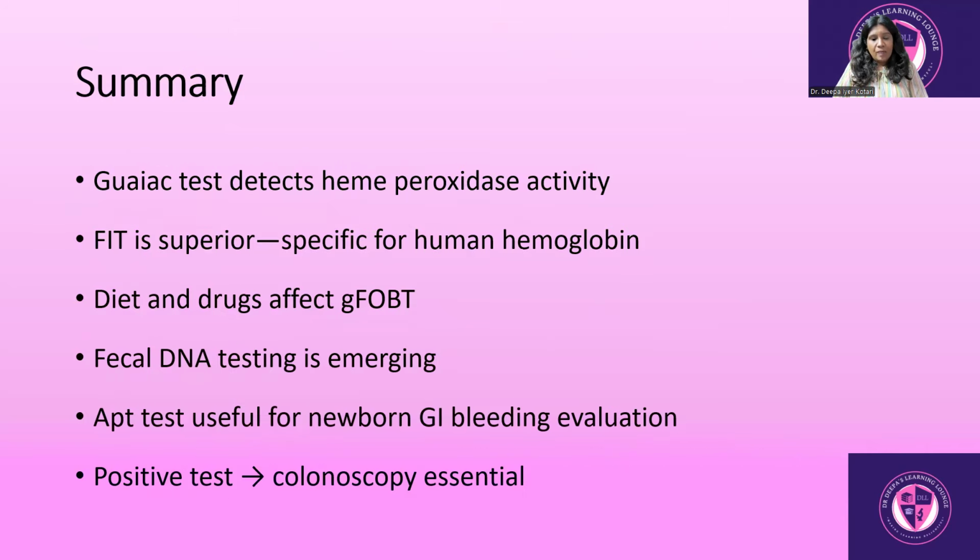So, in summary, what all did we speak about? The fecal occult blood test remains a valuable tool for cancer screening. That is what we spoke about, and it requires understanding of the dietary and technical limitations for the testing. We also need to understand how the patient has to be prepared 72 hours prior to testing, what the false negatives are, and what dietary restrictions you would tell the patient to follow. And always be sure to give the report after 3 different stool samples have been tested.